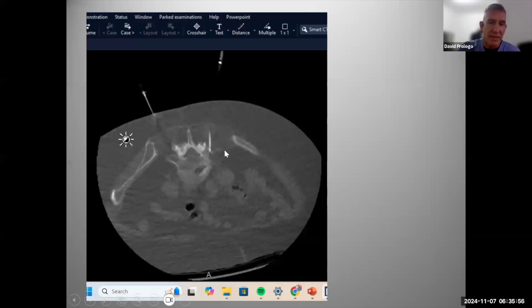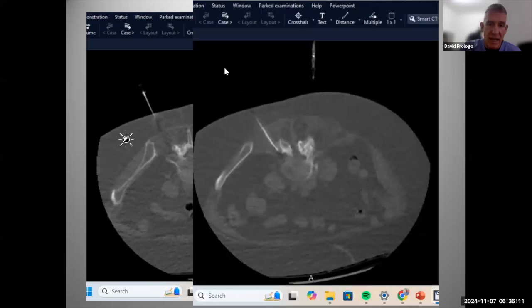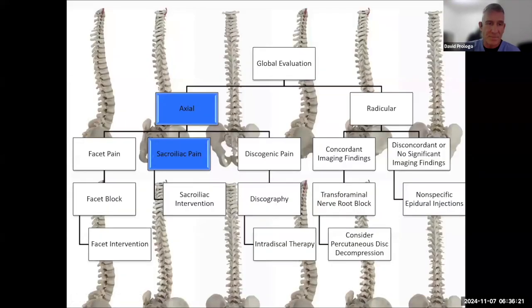It's the same thing. It's the junction of the transverse process, and coming out of the image is the superior articular facet, and coming back and around to these hypertrophied facets is the medial branch. So we set the RFA probe there, one on each side. If you think about this side, the nerve root is coming out, but it's already thrown a branch back here. And when we interrupt that signal, the patient feels a lot better.